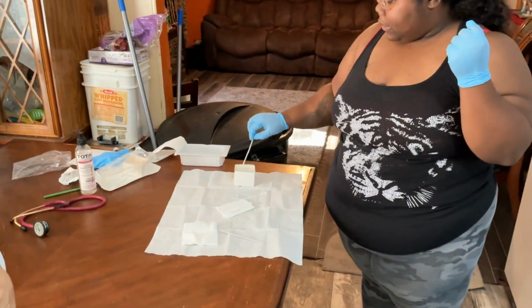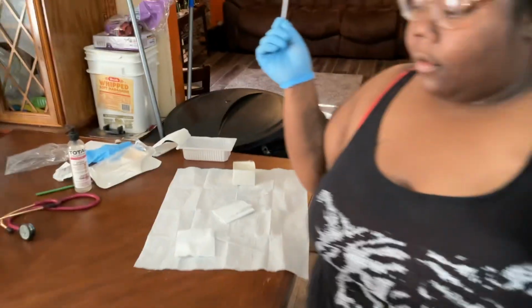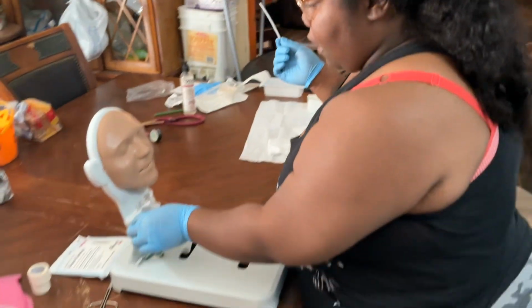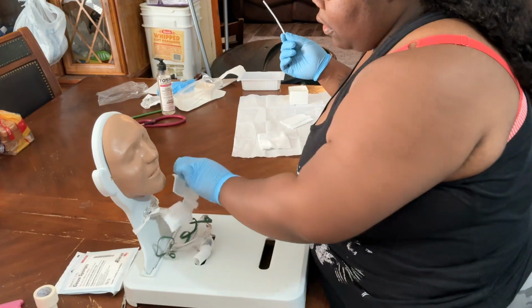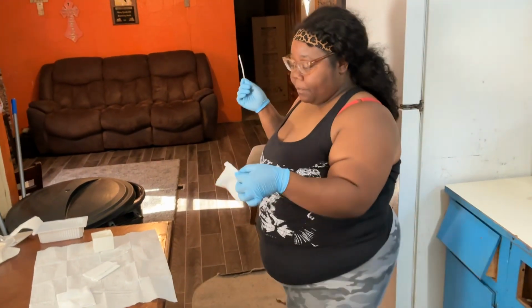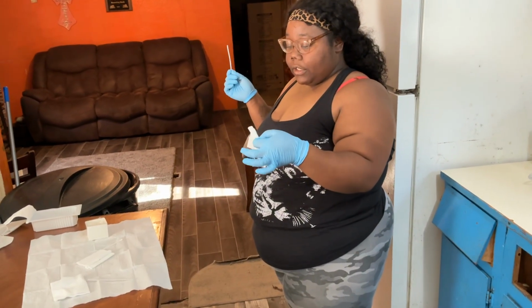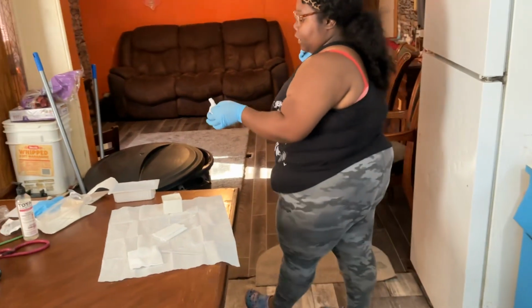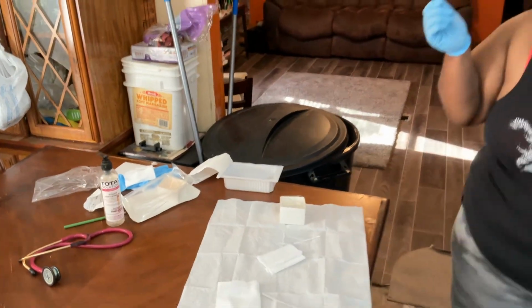I'm going to put this in the clean water. Come around. I'm going to remove my dressing. Okay, I'm going to assess my dressing for any drainage or secretions. So, I will come around, discard that in the appropriate bin.